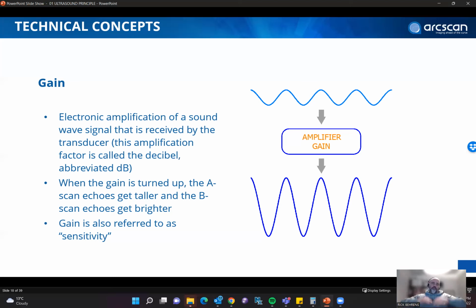Ours is optimized, and we are always reading at the optimized levels. You can modify the gain in the settings. The more gain, the wider and brighter it's going to be. You can overexpose an image. The less gain, the less wide, a darker, dull image.